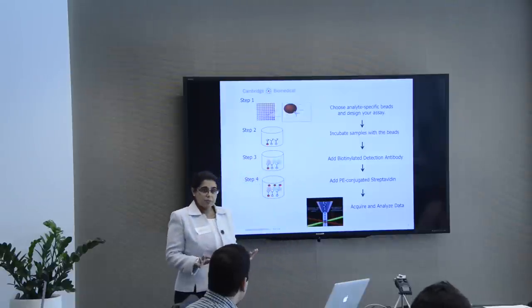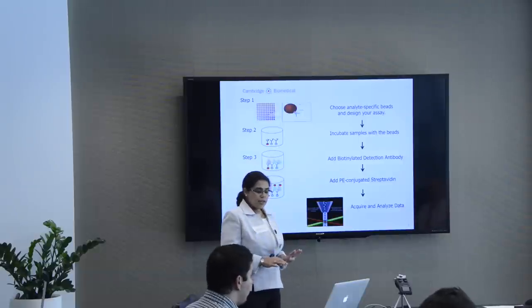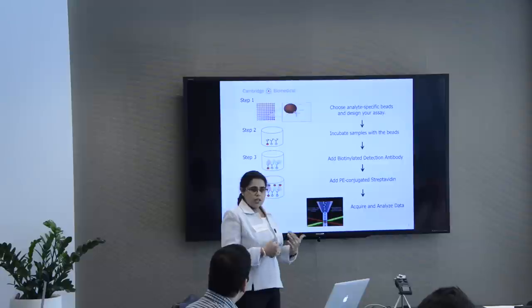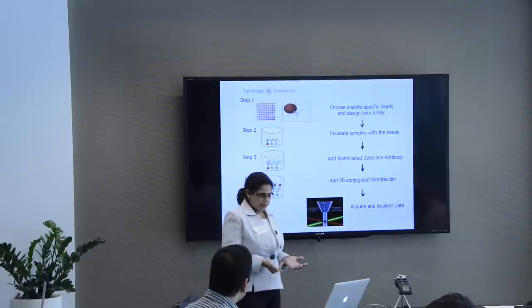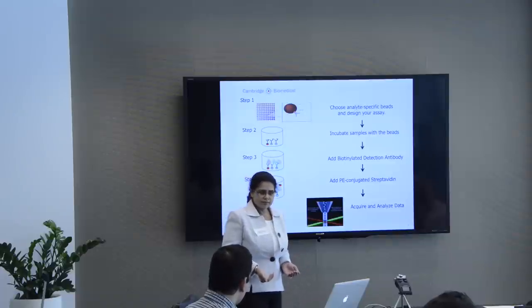The assay is very simple, and this is how it works. You choose your analyte-specific bead, and you design the assay. You incubate your samples with these beads. You add the biotinylated antibody. You add the PE, and then you acquire and analyze the data.